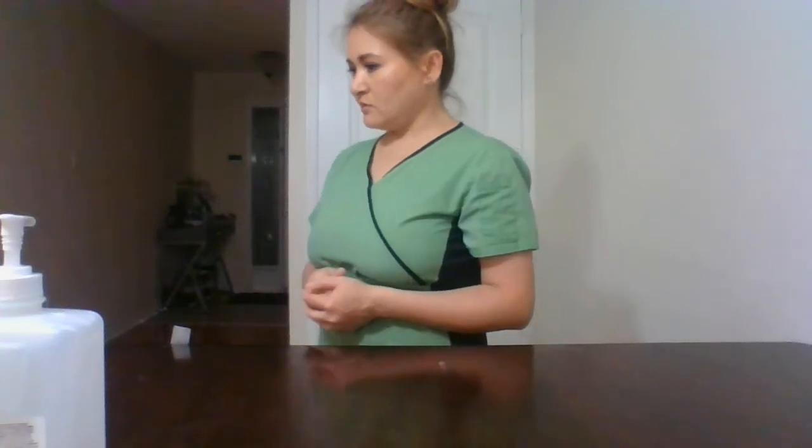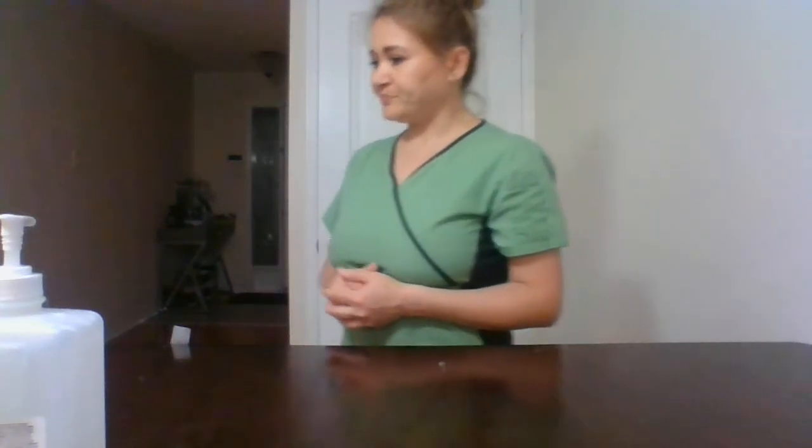Good, good. Do you have any allergies, Mrs. Jones, that we need to know? Any allergies that I need to know? Latex or anything else? No? Okay, great. When was the last time you voided? Great. Do you have any pain right now, Mrs. Jones? No? Okay, thank you.